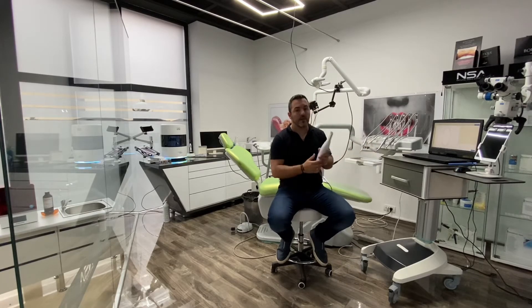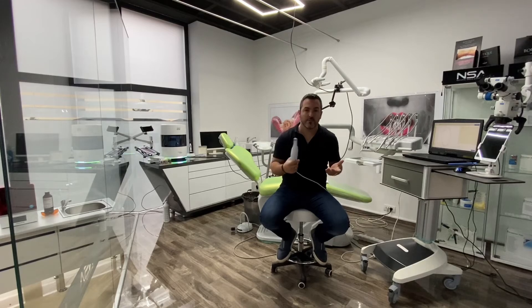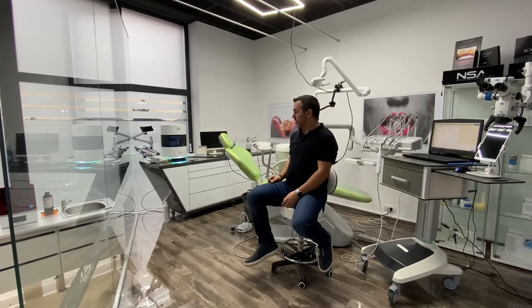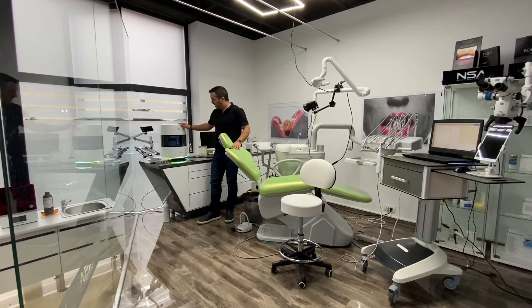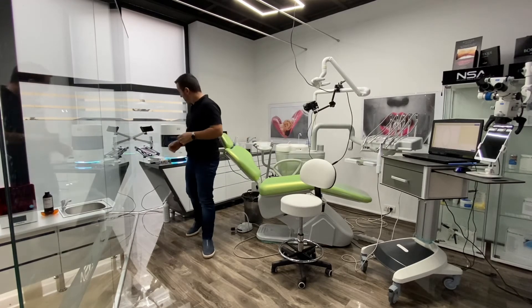Once the patient loves the design and is happy with the shapes and colors after the printing and photos, the next step is to do the preps. After that, you take another intraoral scan, send it to the lab, and the lab — which already did the design for the mock-up — adapts that design to the final design on the prepped teeth. Then the lab sends the final STL files so you can mill them.